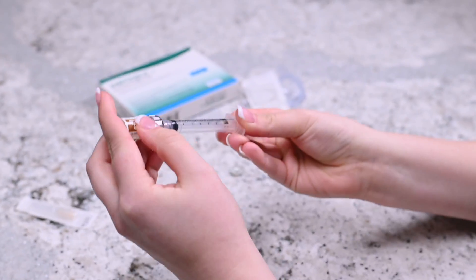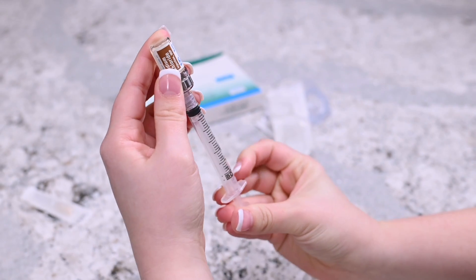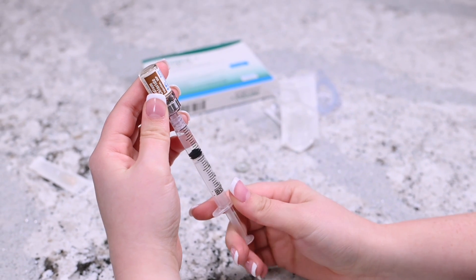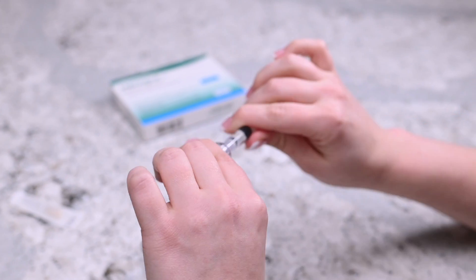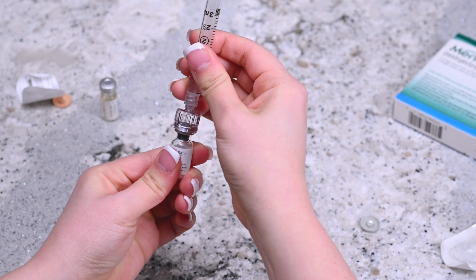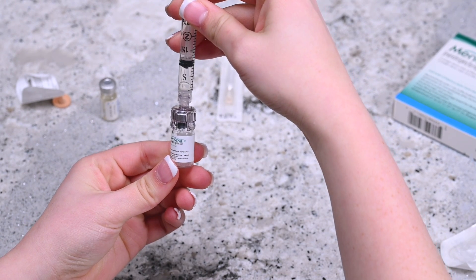Invert the syringe so that the vial is upside down but still attached to the syringe. Pull the plunger back slightly past the 1 ml mark. Remove the syringe with the attached q-cap from the vial and set the vial aside. Insert the q-cap into the rubber stopper on the vial of Menopur powder and release the syringe's content into it by pressing on the plunger.